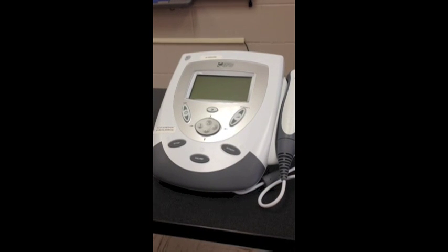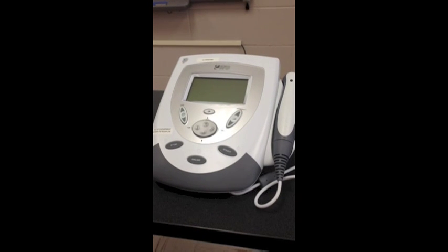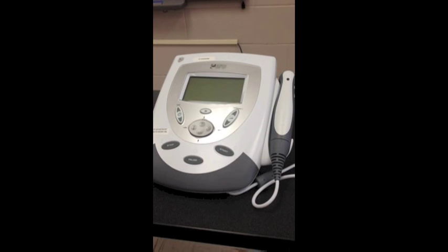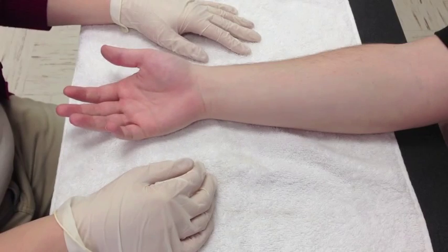Maintain consistent energy transfer. Concentration of energy at the periosteum can produce burns. Avoid the use of intensities higher than those considered therapeutic in acute inflammatory pathologies and over the epiphysis of growing bones.